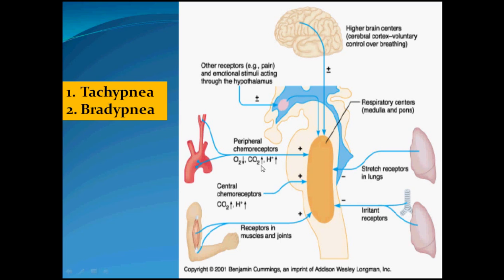Sometimes the increase in carbon dioxide is due to failure to adjust the ventilator. In this case, the minute volume is below normal, and that's why there is carbon dioxide retention. You have to increase the tidal volume in order to increase the minute volume. By the way, the respiratory rate will decrease, so you can correct the tachypnea this way. If the patient is hypoxic, you have to increase the FiO2 or do some sort of recruitment or positioning to correct the oxygen. In this case, the tachypnea will decrease.